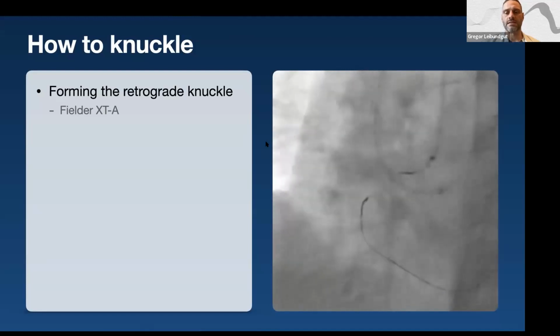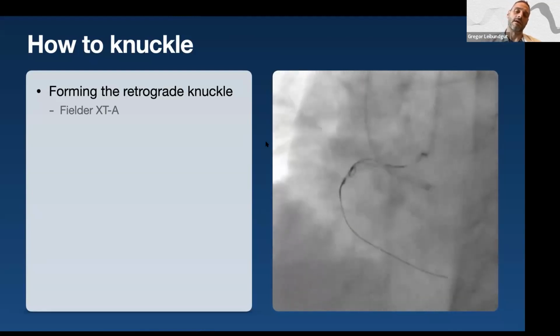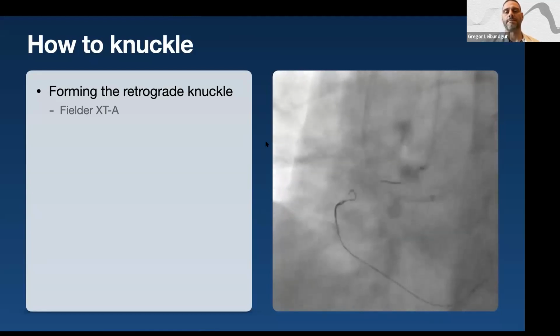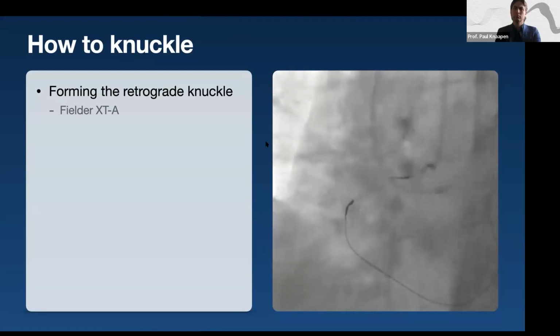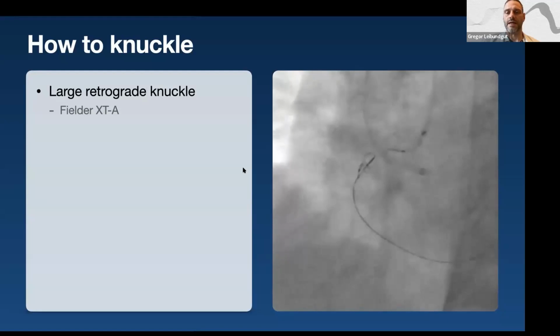First it bends, and I kept pushing, and because of the penetration power being too weak, it forms another loop and another, and there at the fourth loop, when there is more push from the core wire, you can see here the knuckle advances, but it gets pretty big, and so I stayed there with the knuckle at that point, and then tried to come up from antegrade.